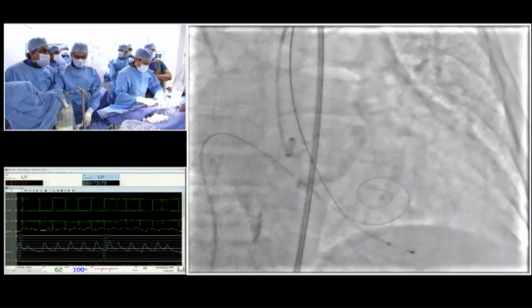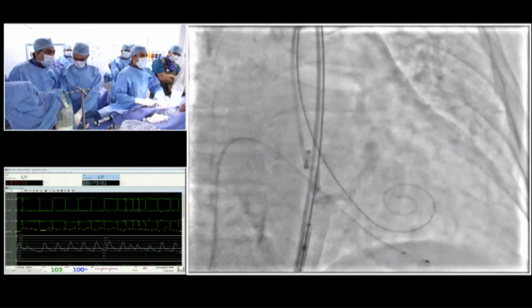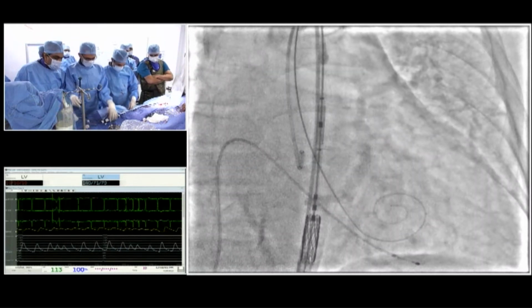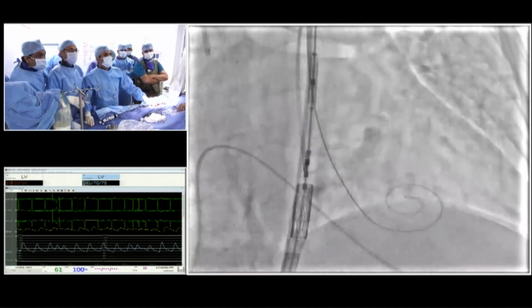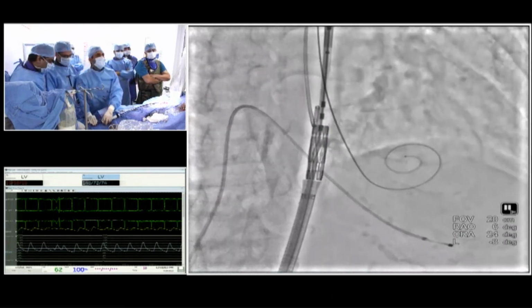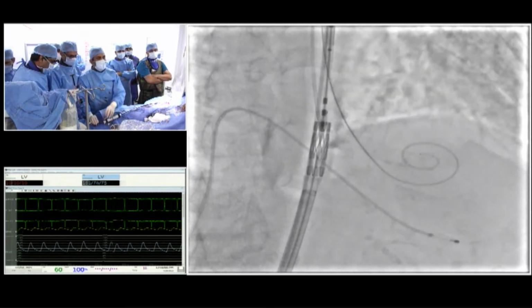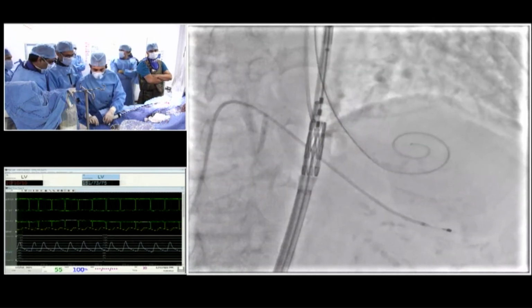So that said, at least in our institution, as I mentioned earlier, we use it for calcium score more than 2000, tight valves less than 0.6, and if you're doing BAVs multiple times, then we would definitely protect the brain. Younger people too. But now I think we are also using Sentinel more and more in general. Even in carotid interventions, we may not see anything there, but actually we have to use it.